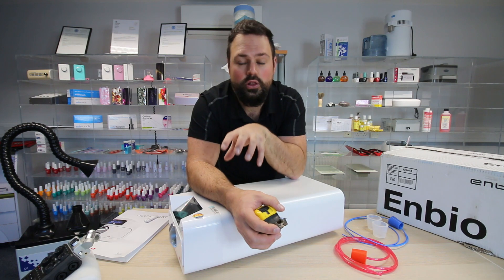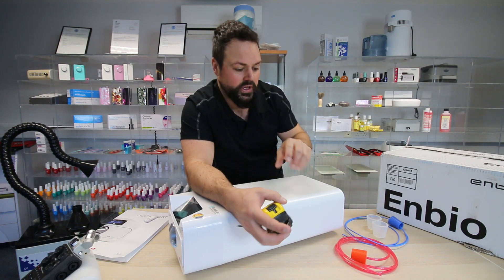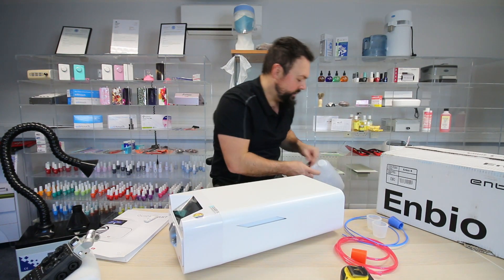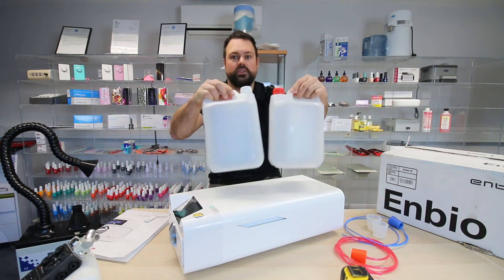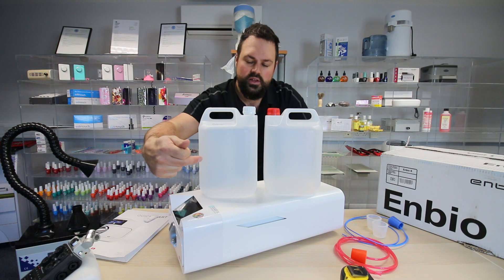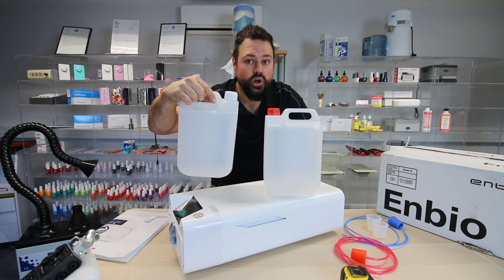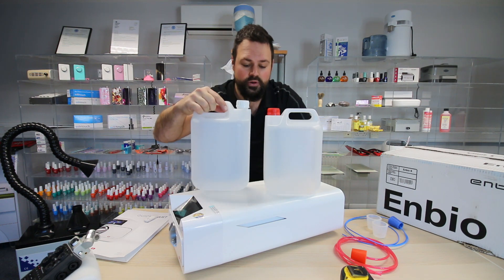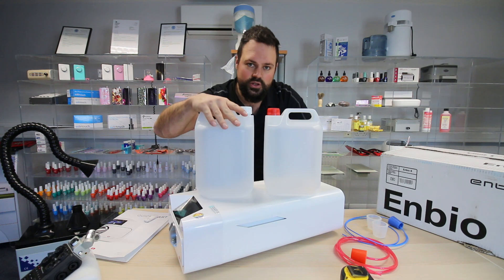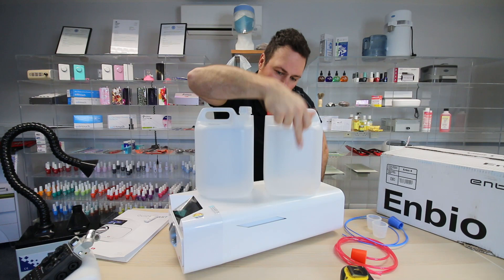This has not got an internal water tank — it doesn't keep water inside. You've got to use external reservoirs. We will be sending ours out with two 5-litre jerry cans. There's an in and an out — 5 litres of distilled or deionised water goes in. That's very important: don't put tap water in, it's too hard. Deionised and distilled water goes in, the machine uses it, and it outputs through the other side.